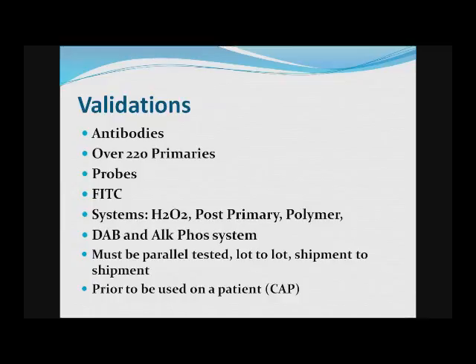The reason is you don't know what happened to that in shipment. It could have frozen, it could have overheated, you could have received a vial that is empty. There's no perfect anything, except we have to make sure that what we test for, and we try to find any type of issues that could happen prior to it being used on a patient.